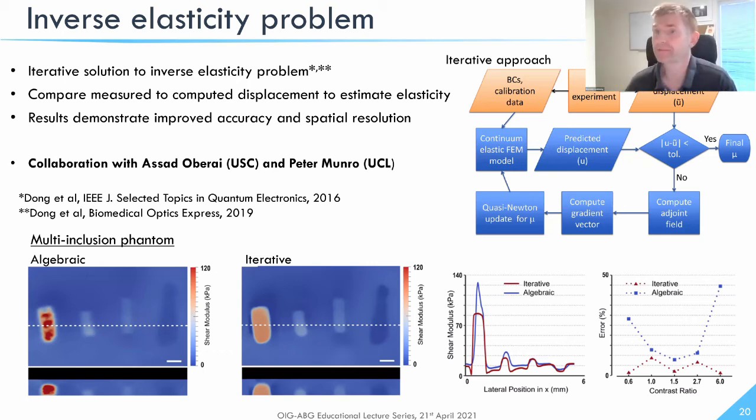It's a great question. And actually, I didn't present it here, but from the in vivo data, we actually made a map of the microvasculature in the cavity. We did that for the reason that if we can identify where the blood is, then we can account for it.